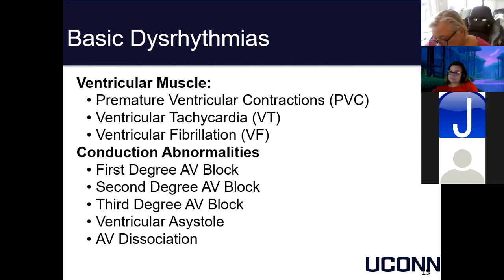So the difference between AFib and bigeminy is AFib is irregular, and bigeminy is regularly irregular? Yes. And I believe I have a picture of it later.